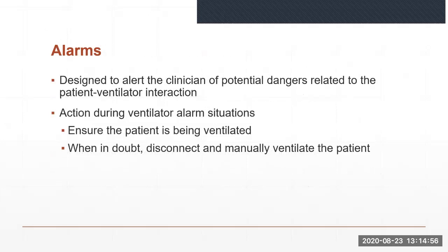Audible and visible alarm systems are designed to alert the clinician of potential problems related to the patient-ventilator interaction. This section reviews the most commonly used ventilator alarms and how they are set by most clinicians.